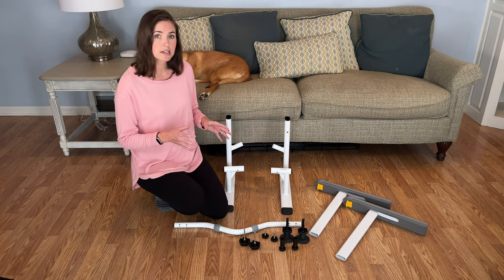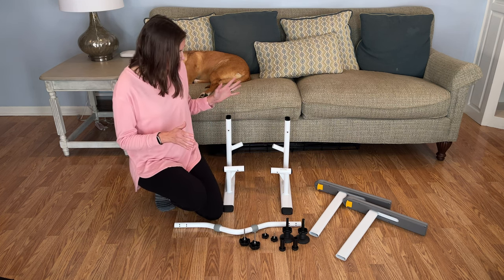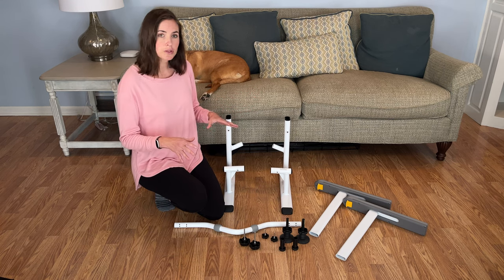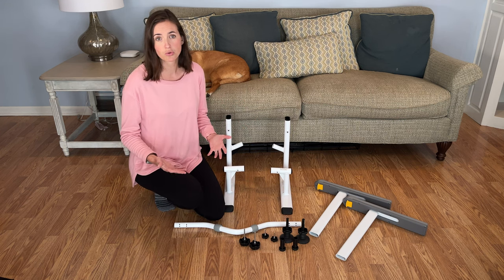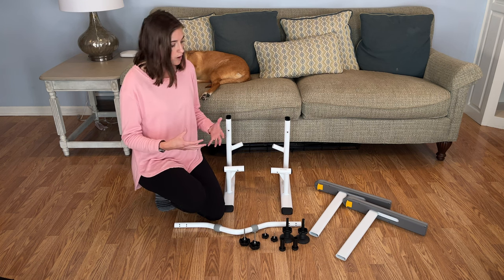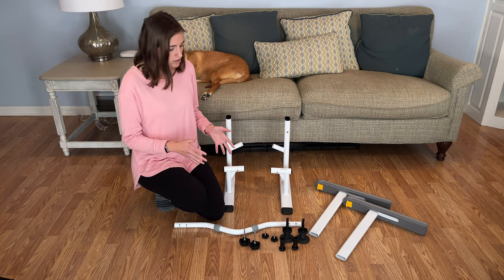So we'll get started here with assembly. None of the pieces require any tools for assembly, and it can actually be disassembled quite easily, which is great. So if you need to place it in storage when you don't need it, or you're going to transport it between locations, it's relatively easy to do.